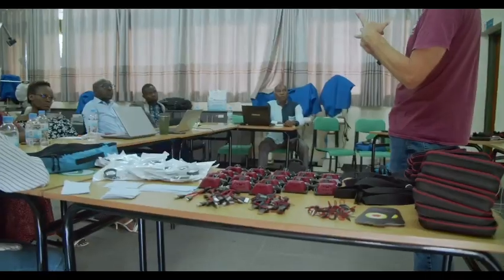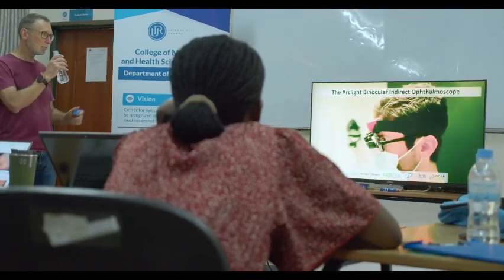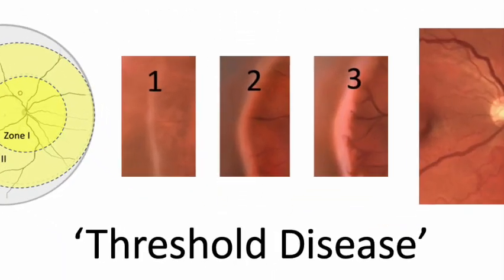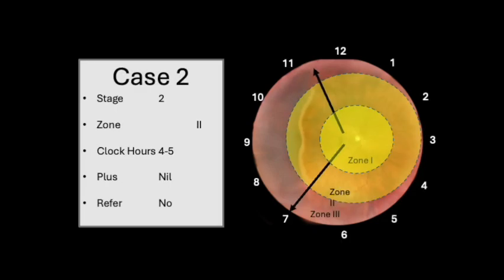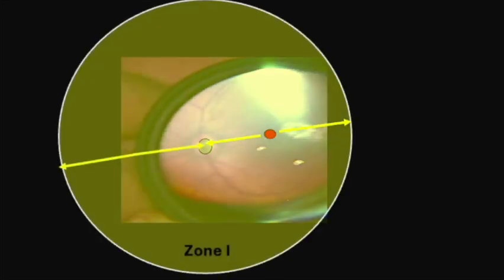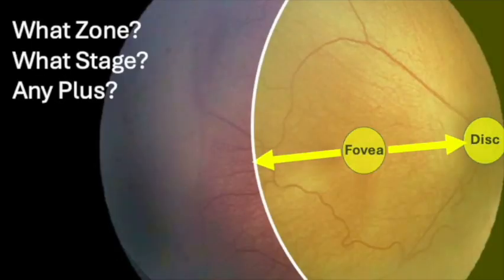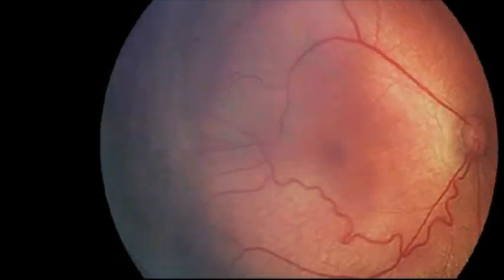When teaching ROP, the three major components of how to describe and identify threshold ROP are emphasised, with case-based discussions systematically going through each step needed to decide if a baby has threshold disease and needs treatment, or can be reviewed or discharged. Videos of real examinations are then shown, relating zones to the actual view seen using an indirect. We also use edited and annotated time-lapse videos to emphasise zones, as well as the development of plus disease, highlighting this is not a binary sign but a spectrum.